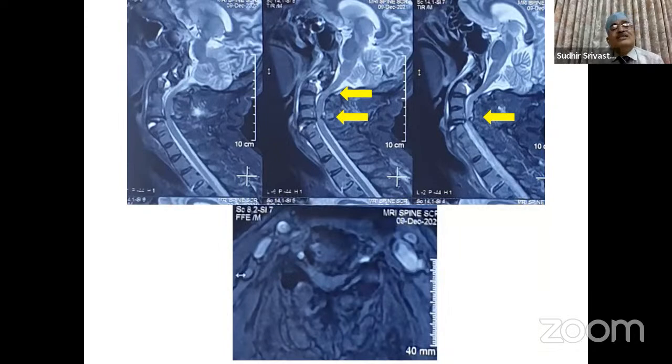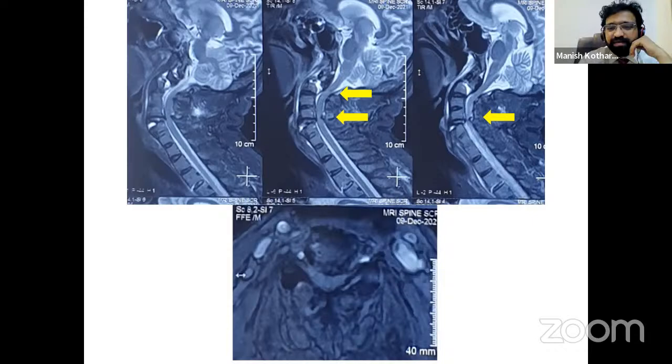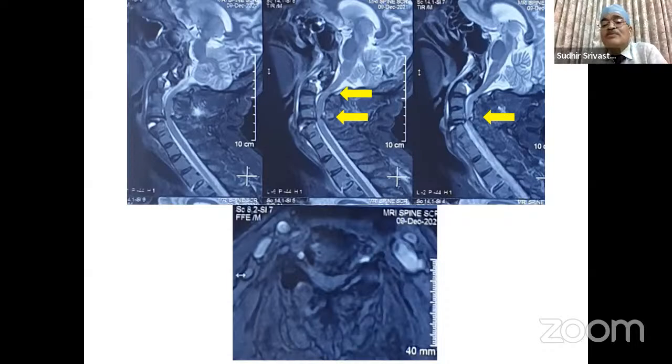First, alignment. Now, since you mentioned that this patient was put on traction and he started deteriorating, worsening paresis, whether it was at the higher level, at the dens level, or the lower discal injury, which had some problem. And in the axial cut, you have, I think, purposely shown that there is a compression on the left side. The right side root is looking all right. Left side root is compressed. So I think you are the best one to proceed with this case because you know from the beginning to the end what has happened to the patient.